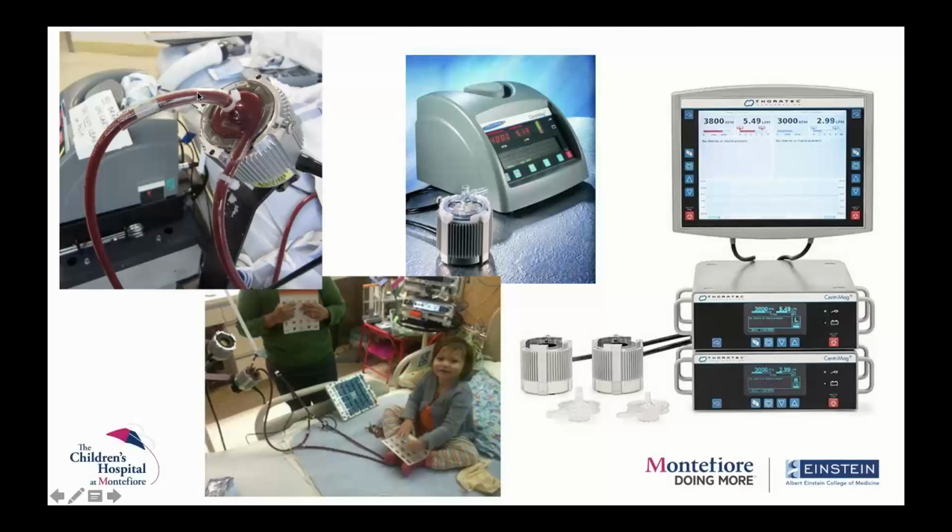This is a close-up of the device itself. You have one cannula that brings the blood out into this device and another cannula that takes the blood back to the body. This is how the system looks to us as physicians. And on the right here, you see a system that is set up for BiVAD. Over here on the left in red, you can see the left side, which means the oxygenated blood, the red blood. And on the right here, you see blue. In blue, you have the right side of the heart that is supported, the deoxygenated blood. You have two displays here, and these are the two slots. So this is how two sides of the heart can be supported by two different pumps connected to the same machine and monitor.